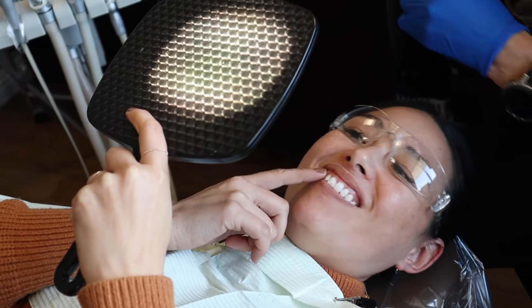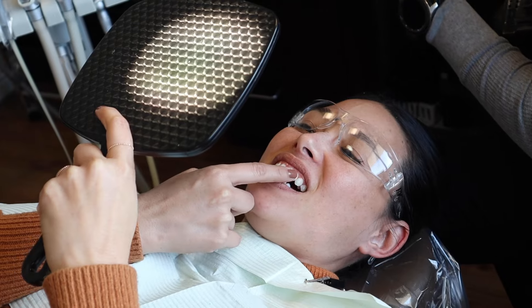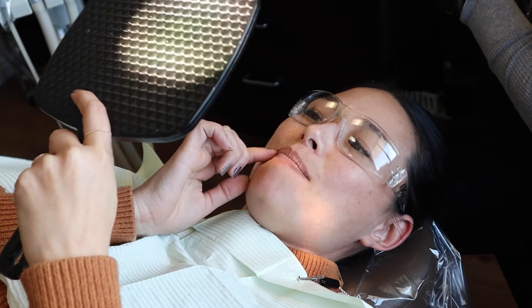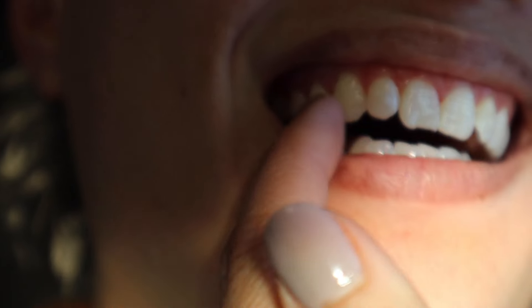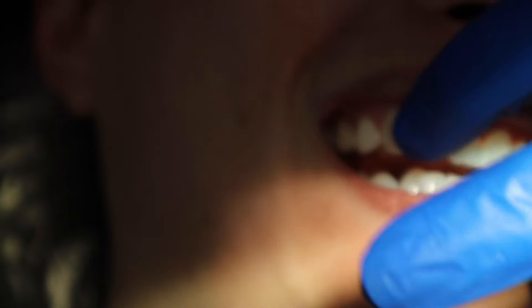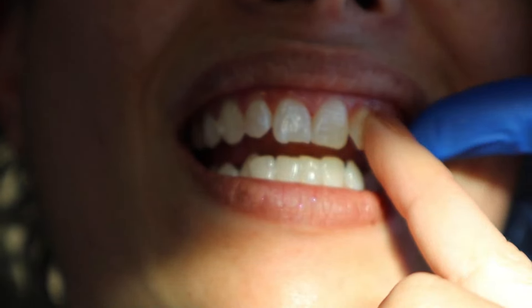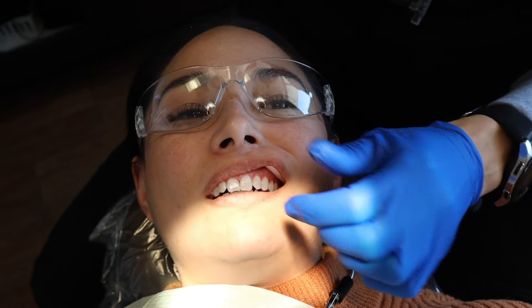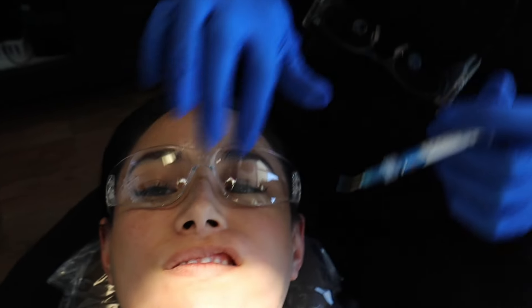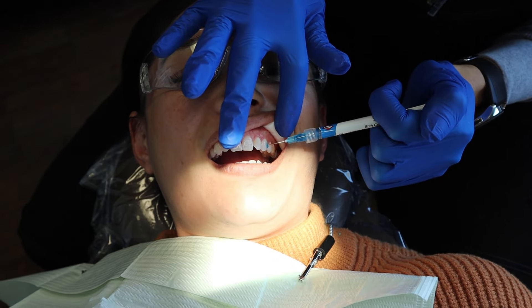These are just a hook on the thingy — it's like a vampire. They're huge, but they're not. I didn't even know that you had to do that. There's one here, and this one is small. There's one here too — yeah, I felt that one. So you actually feel it more when you don't have the trays on versus when you have the tray on. It forces you to put the tray on so you don't feel it. Exactly. And at the beginning it's annoying, then after that it's fine.